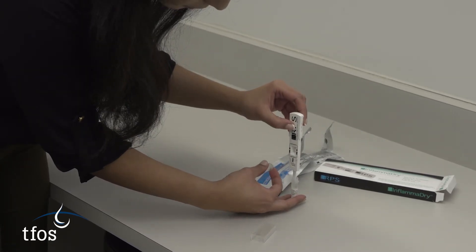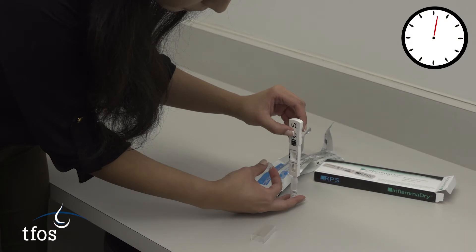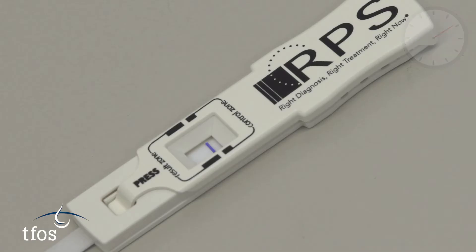The result will be seen after laying the holder flat for a period of 10 minutes. After 10 minutes, there should be a blue line present in the test card window, which confirms that the test has worked correctly.